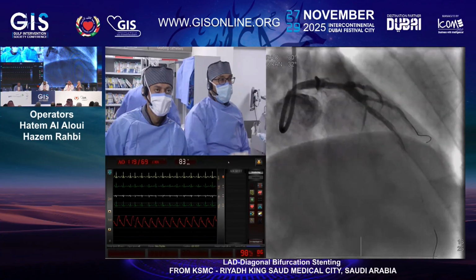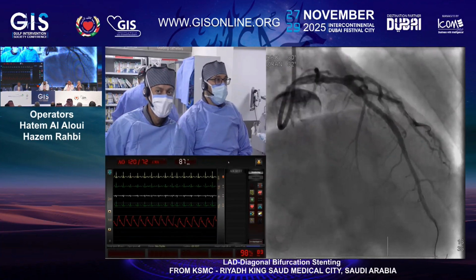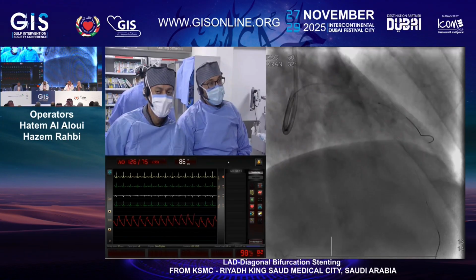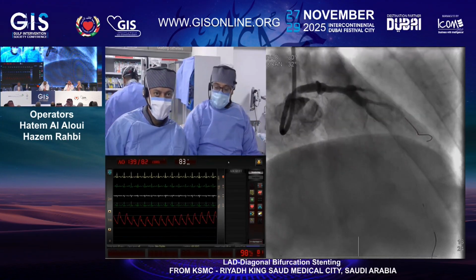He can be followed very closely, and if he has any symptoms, we can go again and complete the job. Team, what's your opinion, Dr. Mbarak, Dr. Hazem?